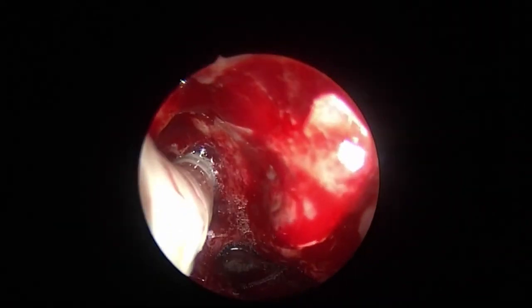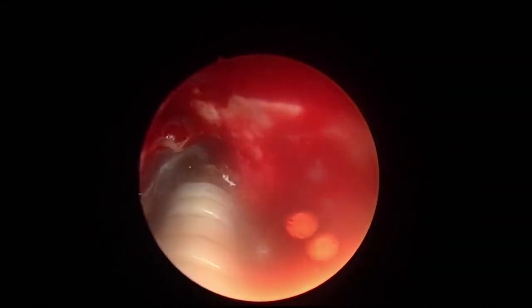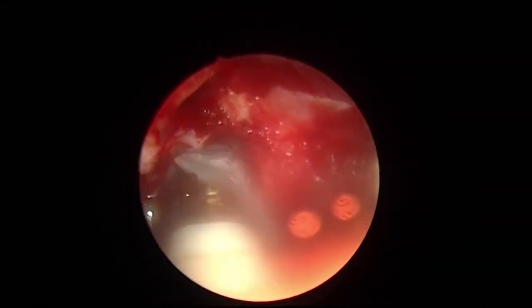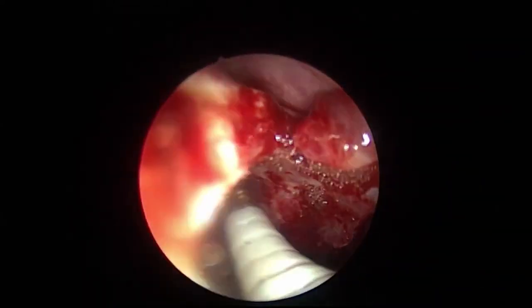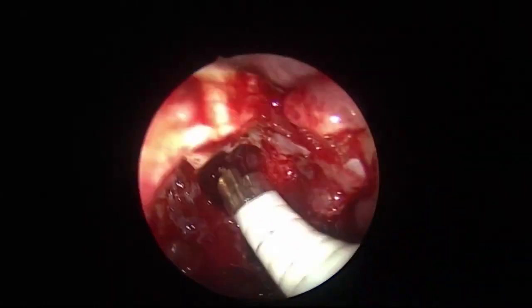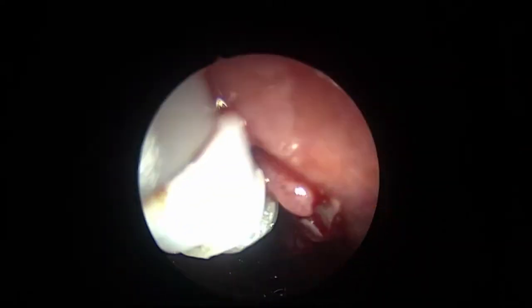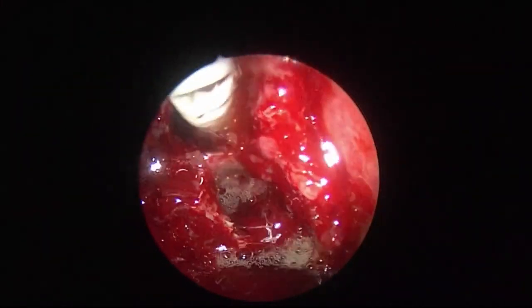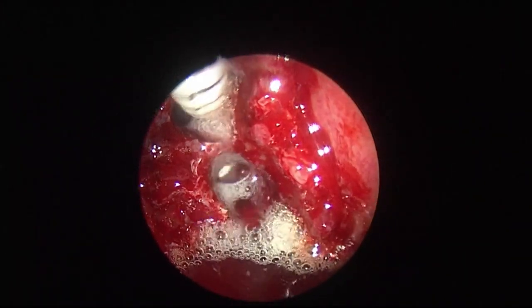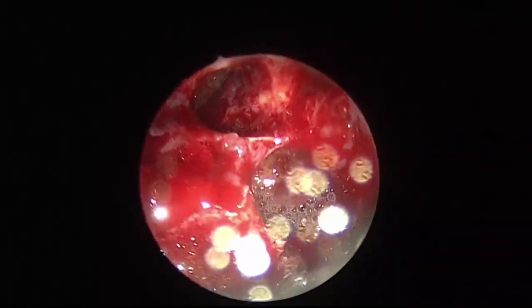The hydrodebrider, 360-degree jet of water, high pressure water. See the pressure. Look at the pressure of the jet. You can see the water, very high pressure. So what I will do, rotate inside the frontal sinus everywhere. It cannot leave any fungus behind. This fungus will be washed out with this. So that is about the frontal sinus. See that? Yes, very clear.